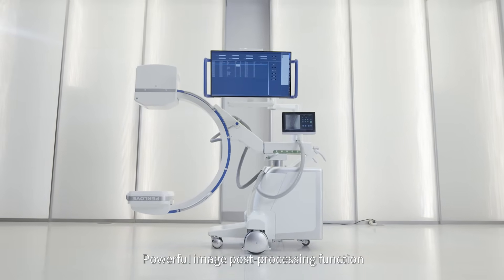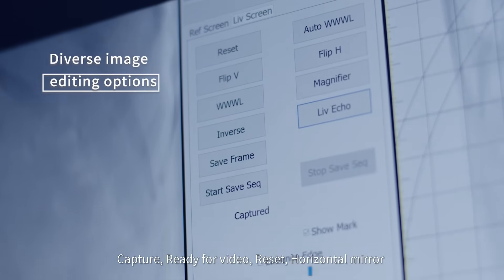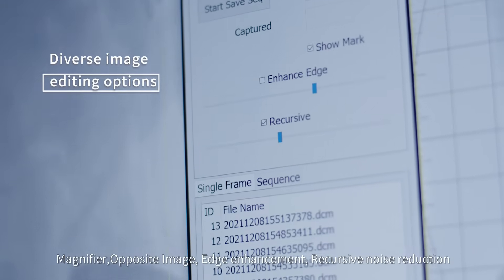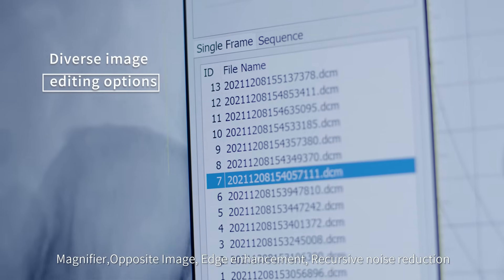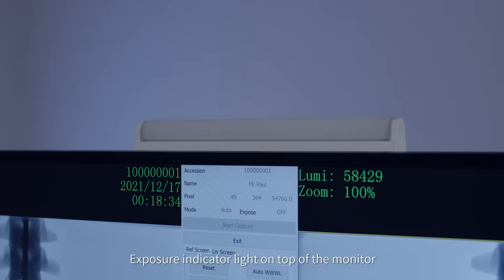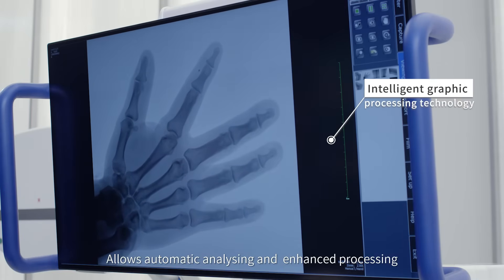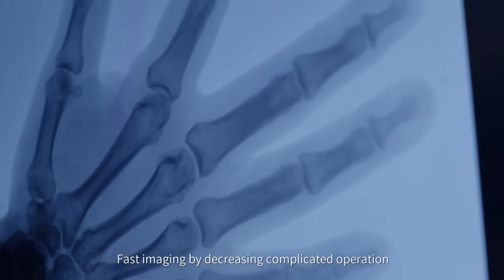A 32-inch 4K resolution LCD monitor with dual display provides clear and detailed images. Powerful image post-processing functions include: capture, video recording, reset, horizontal mirror, vertical mirror, window adjustment, magnifier, opposite image, edge enhancement, and recursive noise reduction. An exposure indicator light sits on top of the monitor. Intelligent graphic processing technology allows automatic analyzing and enhanced processing, enabling fast imaging by decreasing complicated operations.